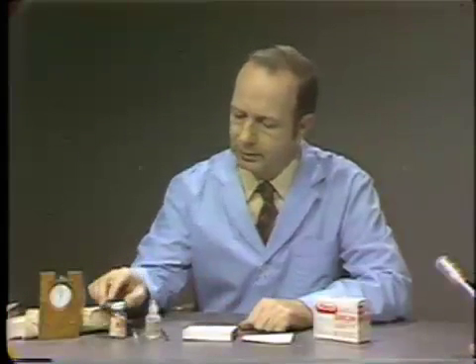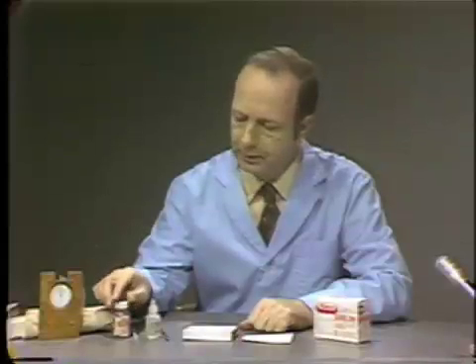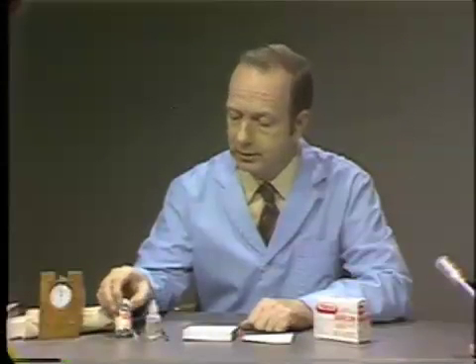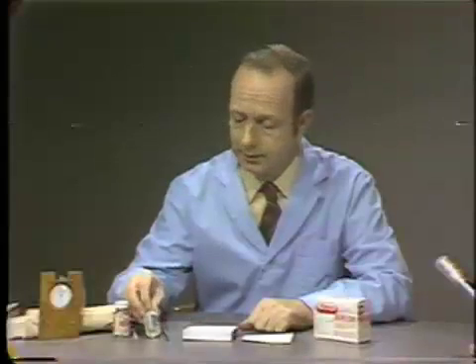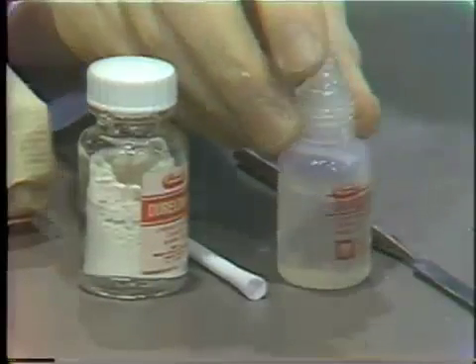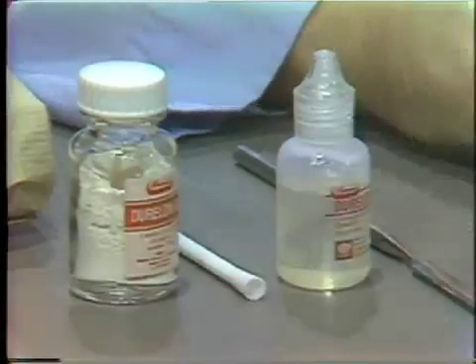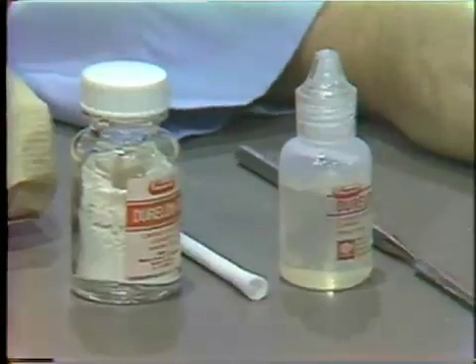Polycarboxylate cements are supplied in a powder and liquid form. The powder is mainly zinc oxide, while the liquid is a water solution of polyacrylic acid. The two materials are mixed together and will set in approximately three and a half to four minutes.